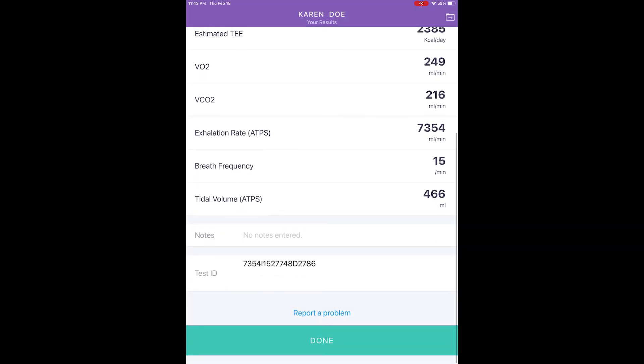Once the measurement is performed, there is a Notes field in the Optional Text Entry field to enter any pertinent information. It is important that once all the information is revised, you press Done to record the measurements in the records.